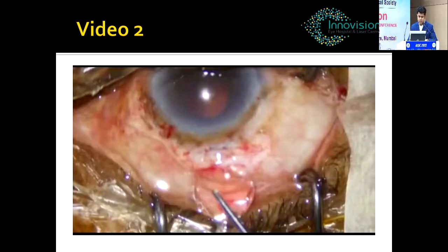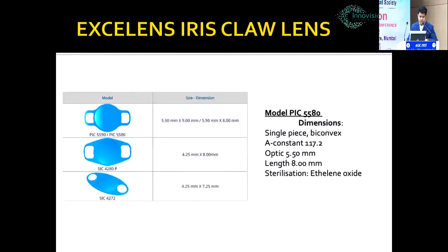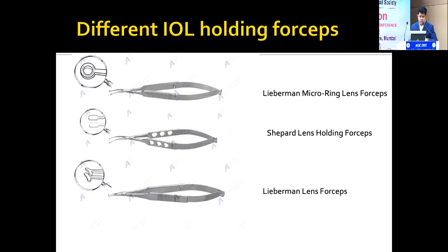Can we conclude? Okay, I think we have short time. These are a few of the lenses that are available in the market, and a few of the IOL holding forceps. I use the Lieberman forceps from Appasamy, the T forceps.